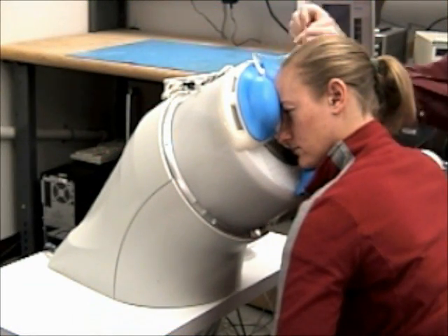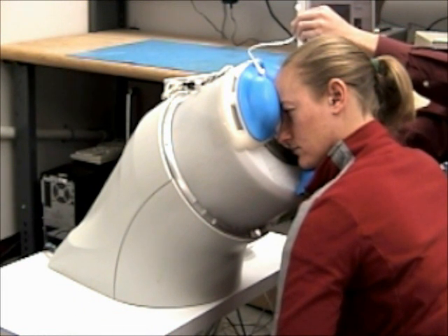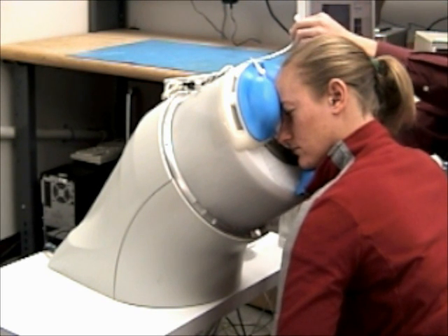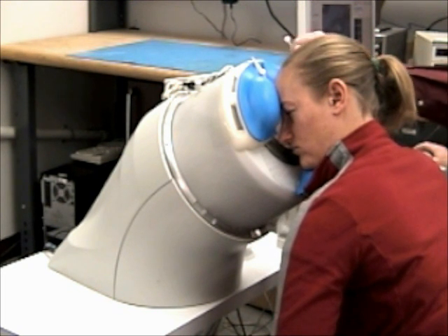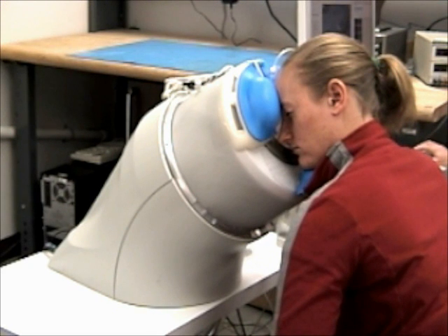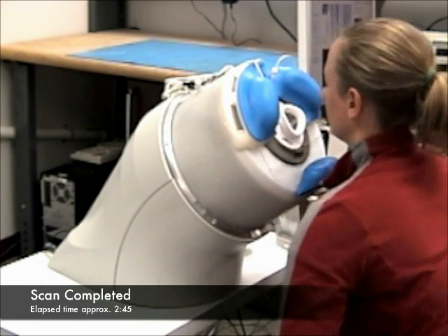The next thing I do is drain the fluid from the eyepiece. I disconnect the source container and allow the fluid to drain down into the waste bag that is attached to the disposable eyepiece. This takes just a few seconds. During this time, you can review the scans and start generating reports. It looks like the eyepiece is totally drained, and we're done.